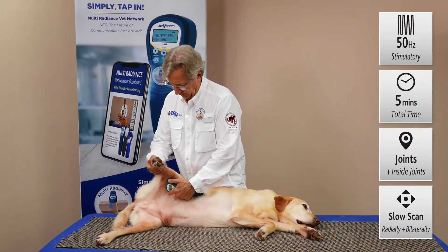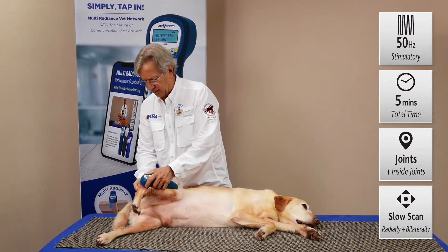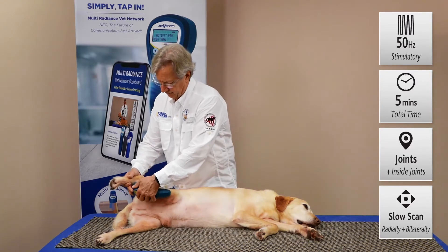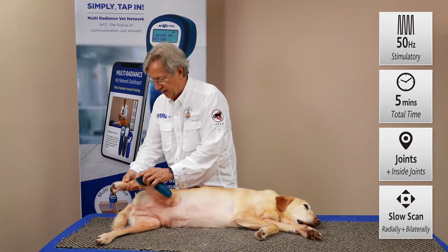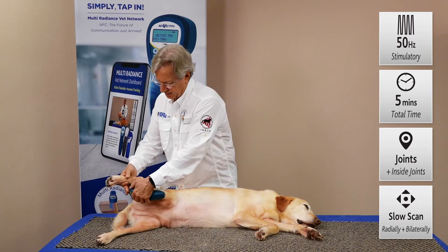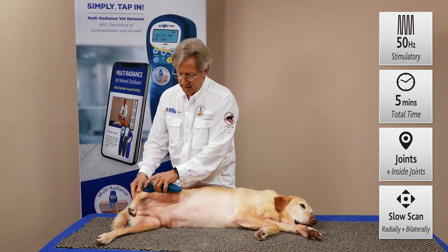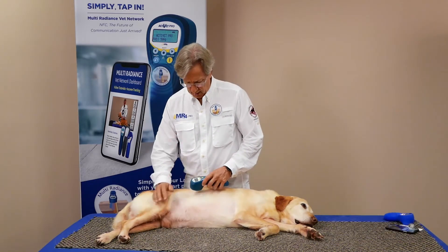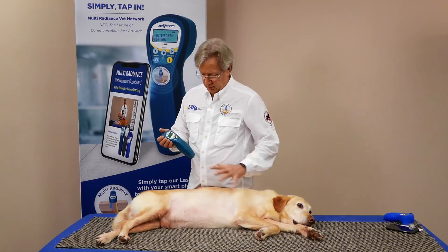By just gently flexing it, you're getting that energy inside the joint where it can do the most good. Repeat that at each joint radially, about a minute to two minutes depending on the chronicity, age, and size of the animal. Just like this is plenty to start seeing some really nice results. Then repeat bilaterally on the other side. That's the unwind protocol with the arthritis protocol to improve blood flow and make more ATP to improve the healing.